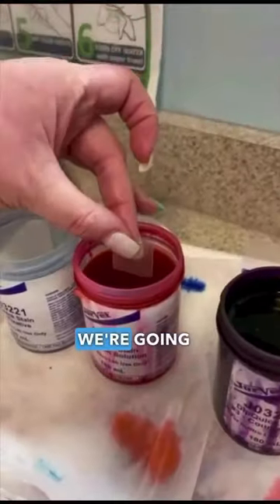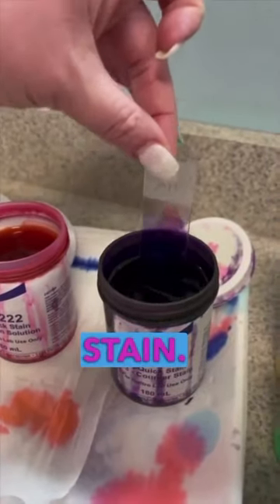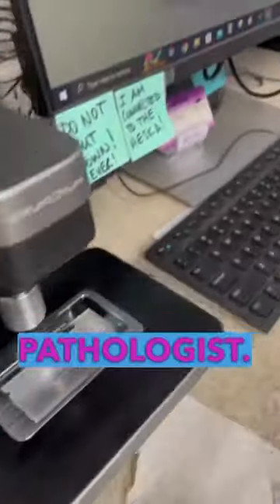We simply stain the slide in-house with Dip Quick stain. Then I log into my VetScan Images account, and for that case we provide patient history for the clinical pathologist.